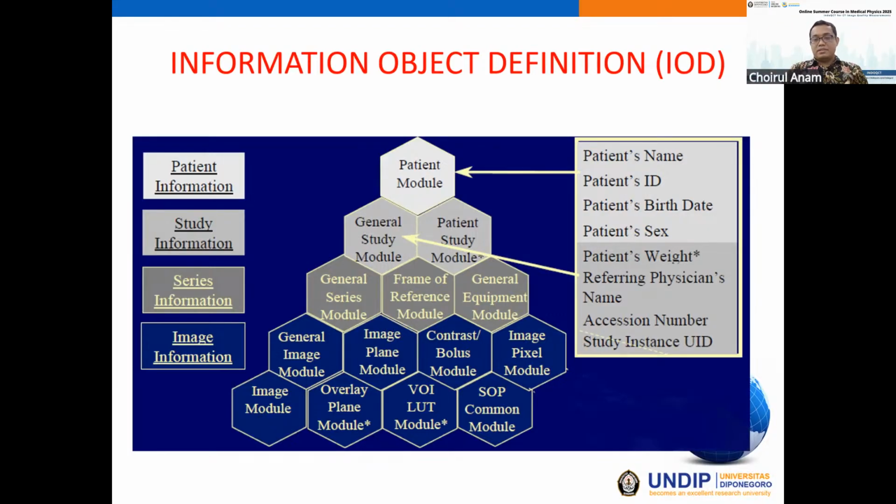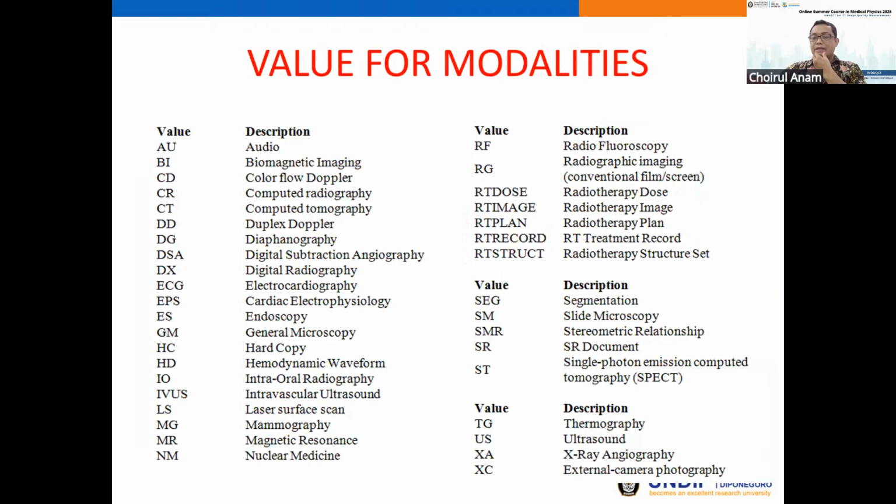So all information is stored in the DICOM with a specific standard. This is the example value for modalities. For CT, the value is CT. For example, for the DR, for endoscopy, ES, and so on. So there is a standard for every modality.